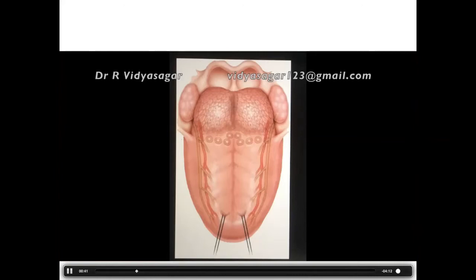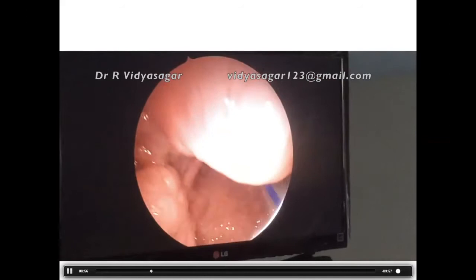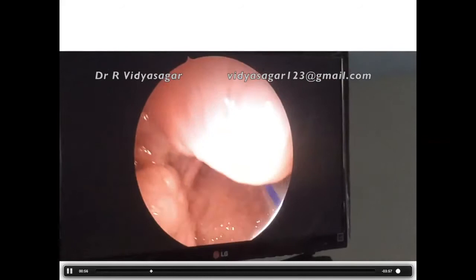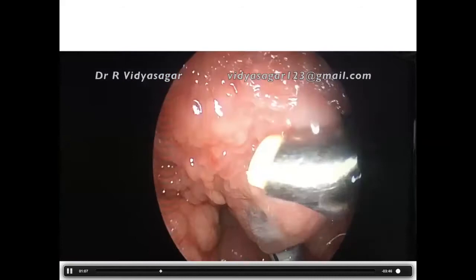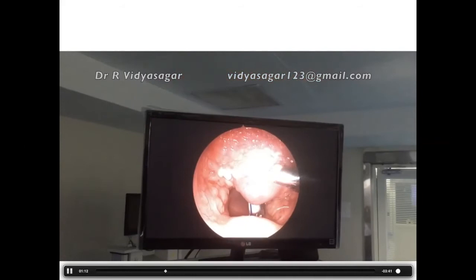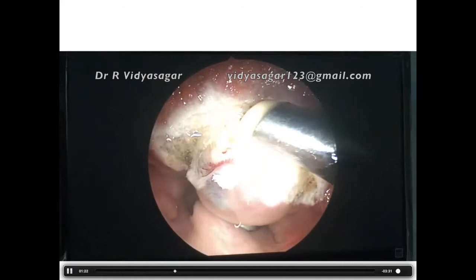Our plan was to excise using the coblator with a trans-oral approach, avoiding any external incision. Unlike the traditional trans-cervical approach, we used nasotracheal intubation, a Jennings mouth gag, and a tongue stitch, pulled the tongue outside. With a 45-degree endoscope in one hand and coblator in the other, we obtained a plane between the lesion and tongue musculature.